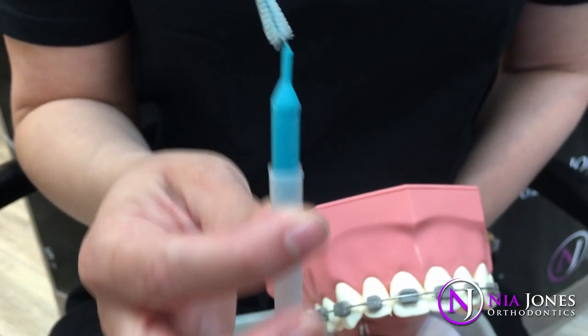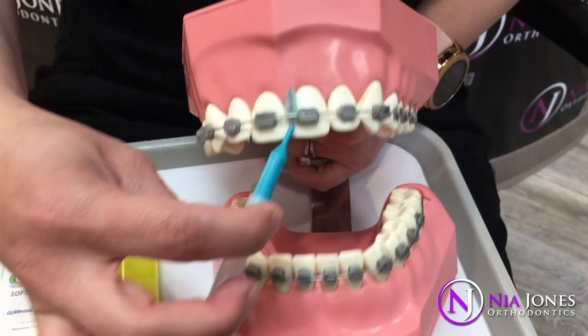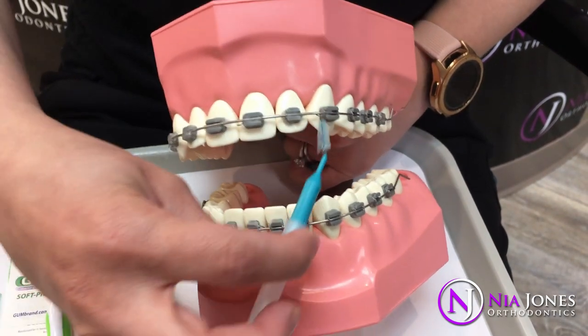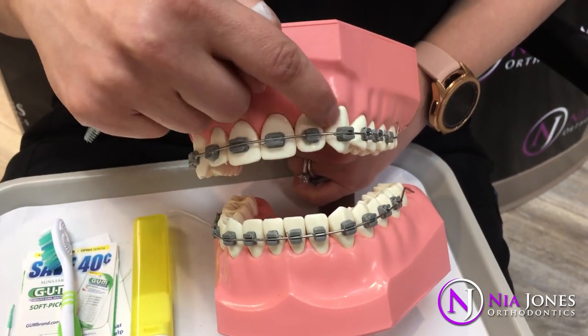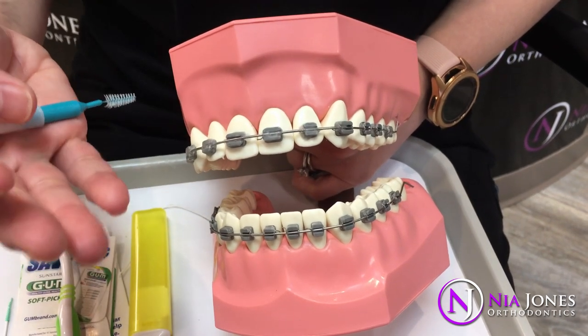This is the Christmas tree brush. This helps you get into all the little nooks and crannies in between all the teeth to get them nice and clean. You want to make sure you get all four sides of the brace clean every time you brush your teeth.